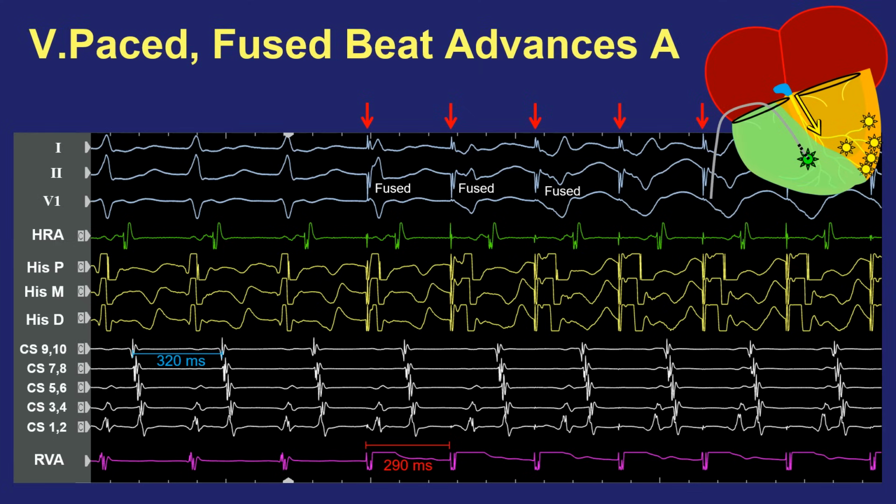Okay, so who cares? Well, we care because, as I'll show you in the manuscript to follow, there is an observation you can make during this transition zone. The transition zone is defined as the period from the beginning of ventricular pacing where you have QRS fusion, including the first beat where you no longer have fusion, the first beat of purely paced morphology.